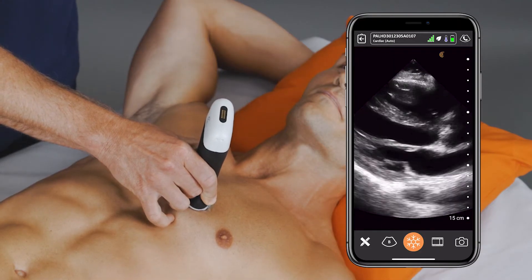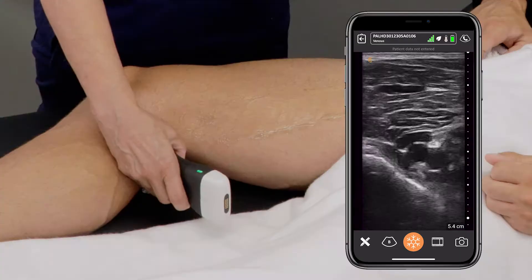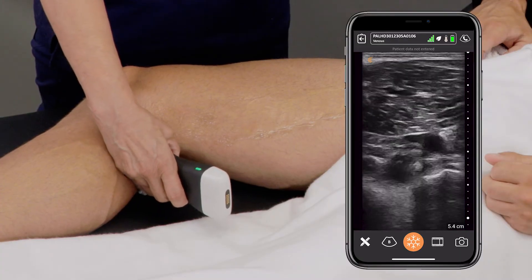The PAL multipurpose scanner can do everything they need in the inpatient setting — scanning hearts, scanning lungs, looking for DVTs — whatever it is on the inpatient service they need to do, the scanner can do all of that for them.